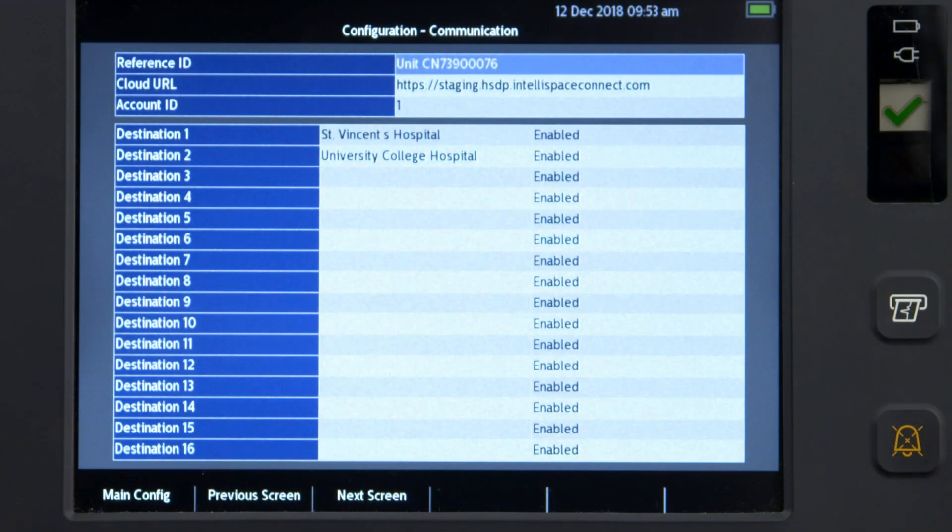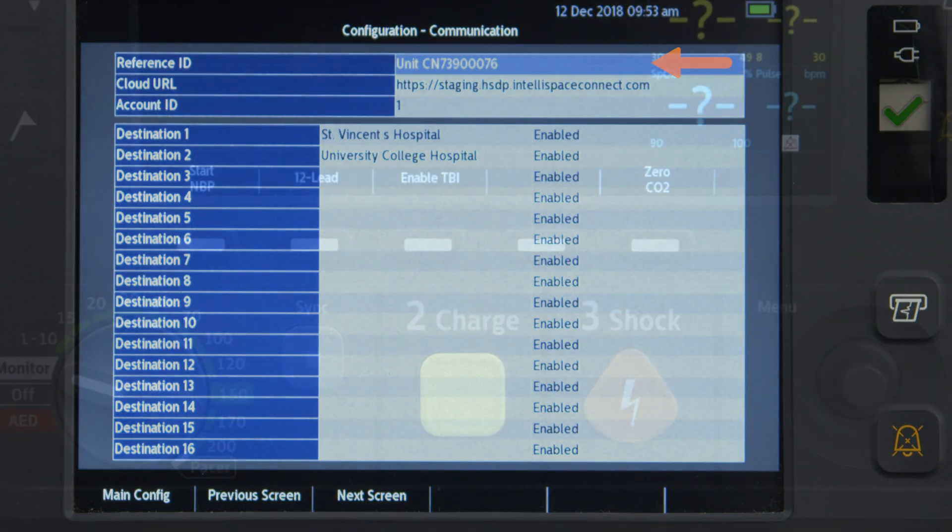To wirelessly send information using either Wi-Fi or the Communication Module, you'll need the Philips IntelliSpace Connect Cloud URL and your IntelliSpace Connect account number, which can be obtained from your Philips representative. Optionally, you may choose to assign a reference ID to identify your Intrepid device.